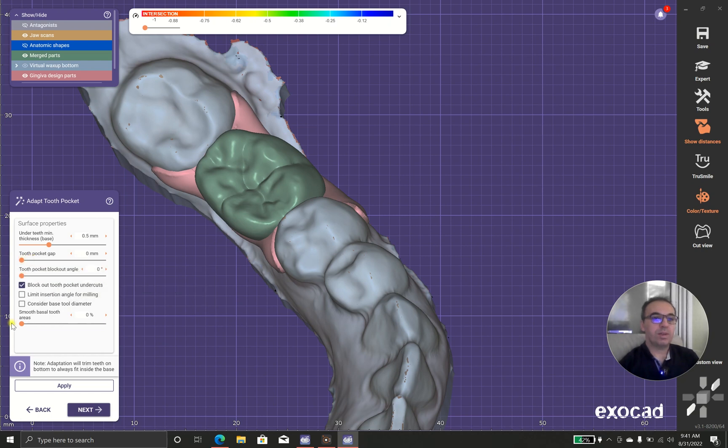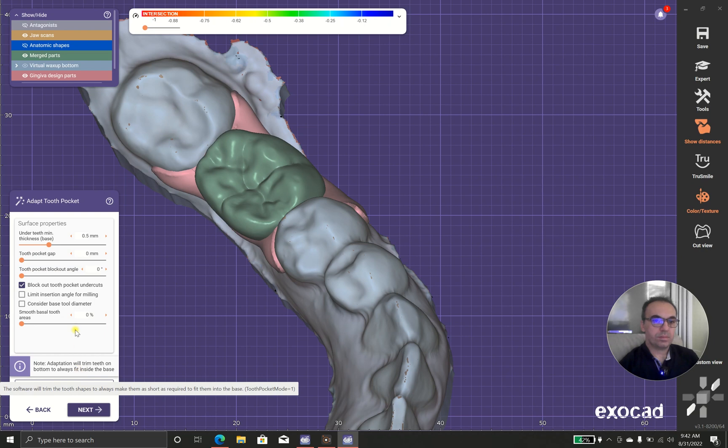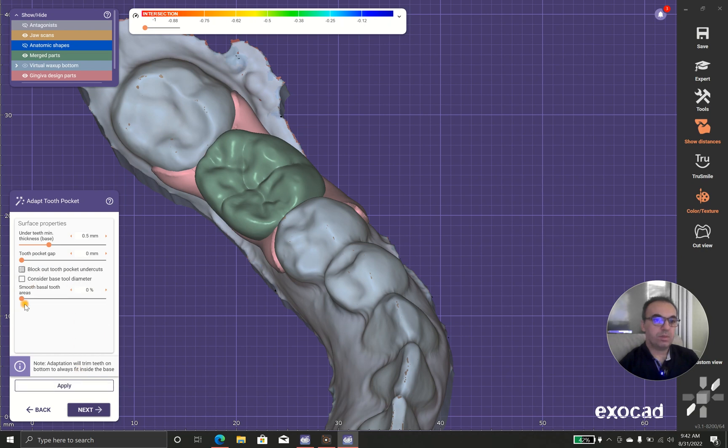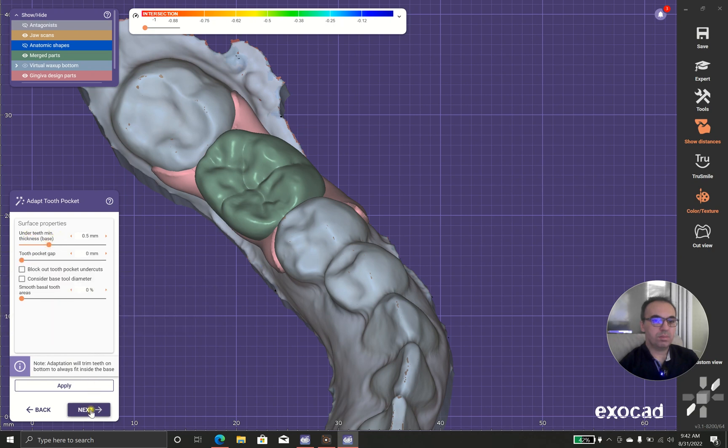And I don't want to block it out. And then under the teeth, minimum thickness by 0.5 is good.